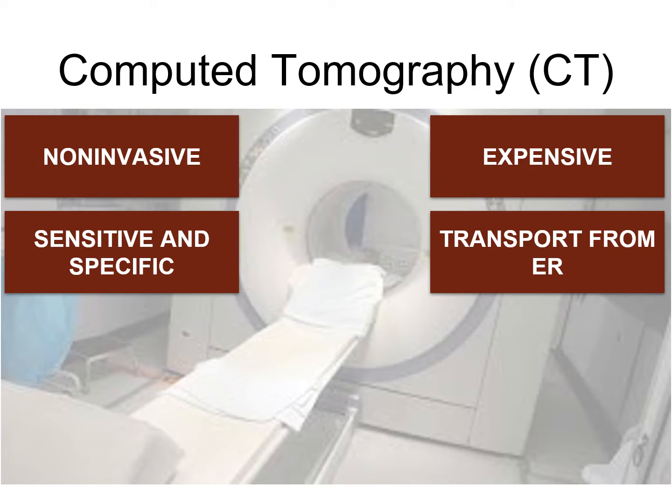The problem was, as a new technology, they were expensive, and they're still not exactly cheap. The other problem was they couldn't be done in the trauma bay. DPL could be done in the trauma bay. CT had to be done down the hall in the radiology suite, which is always a dark, cold, cramped, poorly staffed, poorly equipped room, and it's not a great place to take a sick patient. So this was not a perfect solution because now you were deciding if the patient was stable enough to go down the hall and sit in this dark room where you couldn't really tell how they were doing clinically. So we were still looking for a better solution.